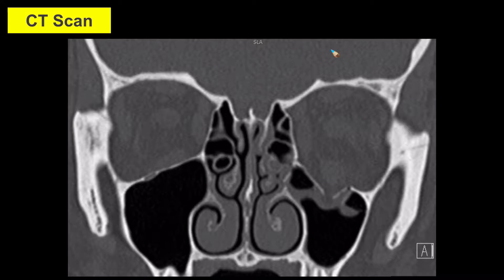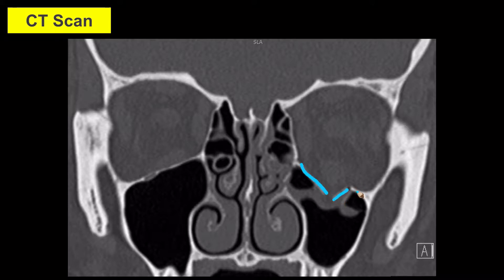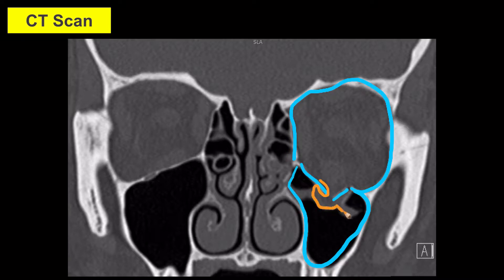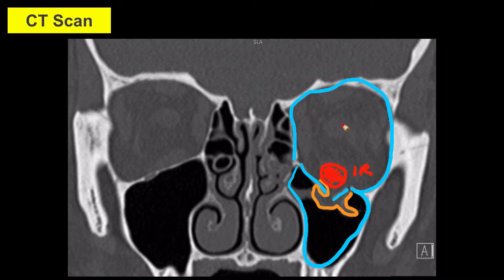Here is a single slice from a coronally reconstructed CT image with bone windowing through the orbits. This slice shows a fracture of the orbital floor with two small flaps of depressed bone making their way into the underlying maxillary sinus. There is material herniating into the top of the sinus, but its density indicates orbital fat, not muscle. The inferior rectus muscle sits just at the fracture gap but has not herniated through it, and all other orbital muscles and the optic nerve are intact.